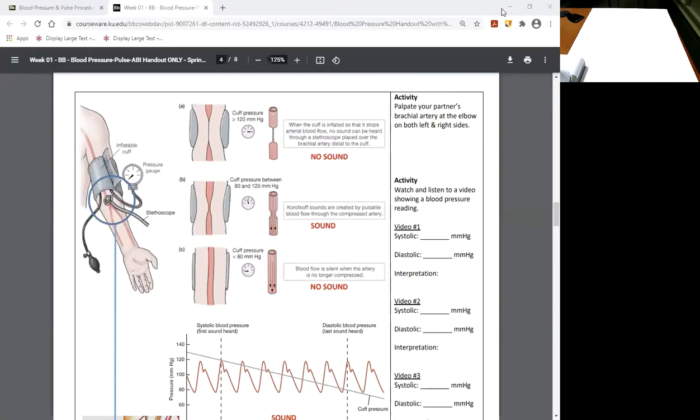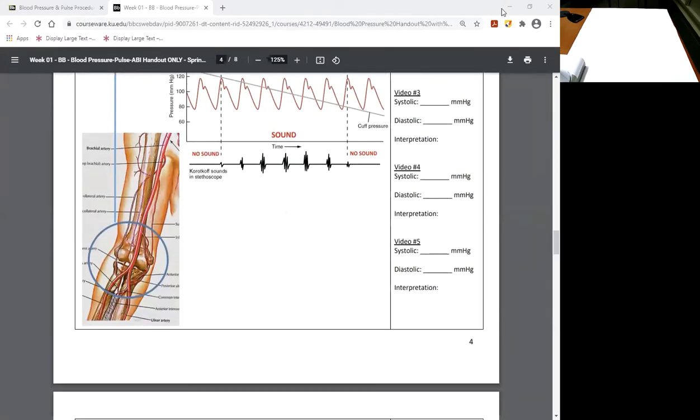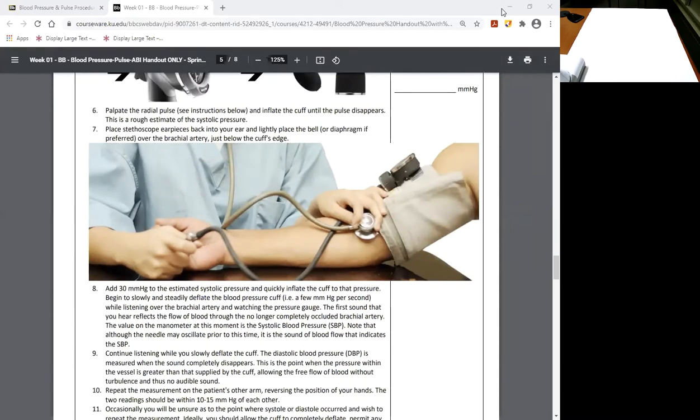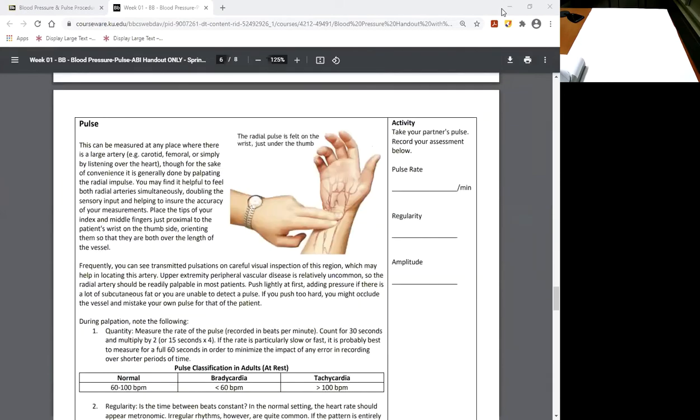So we've talked about the sound thing. At this point, we're about ready to pull it all together in terms of putting the cuff on and going through the whole process and the procedure. All right, before we do that, there's two things I want to bring up. Part of the procedure, and this is an important part, will be to take your patient's pulse. And we're going to be taking a radial pulse. It's called a radial pulse because you're going to be using the radial artery, as you can hopefully see in this image here, to measure this patient's heart rate and feel their pulse.